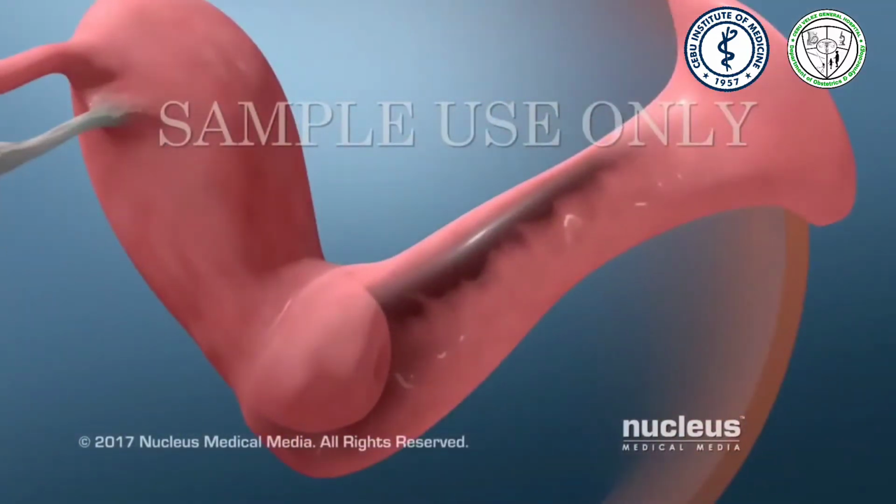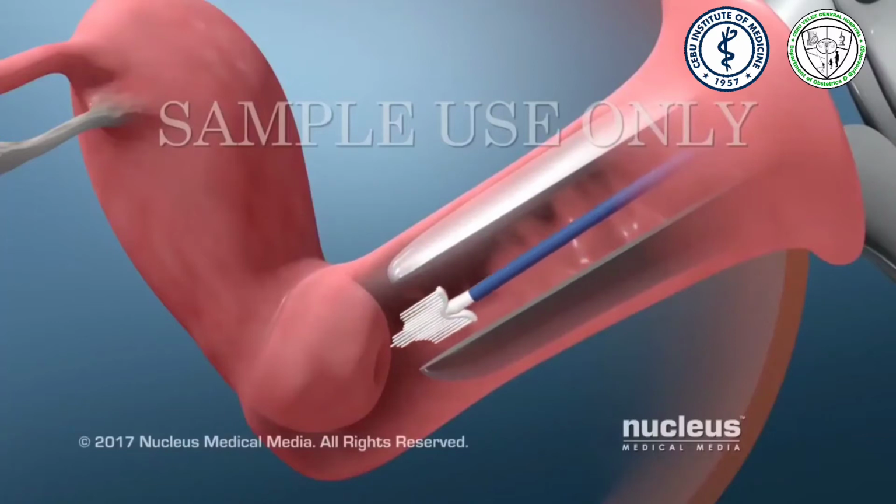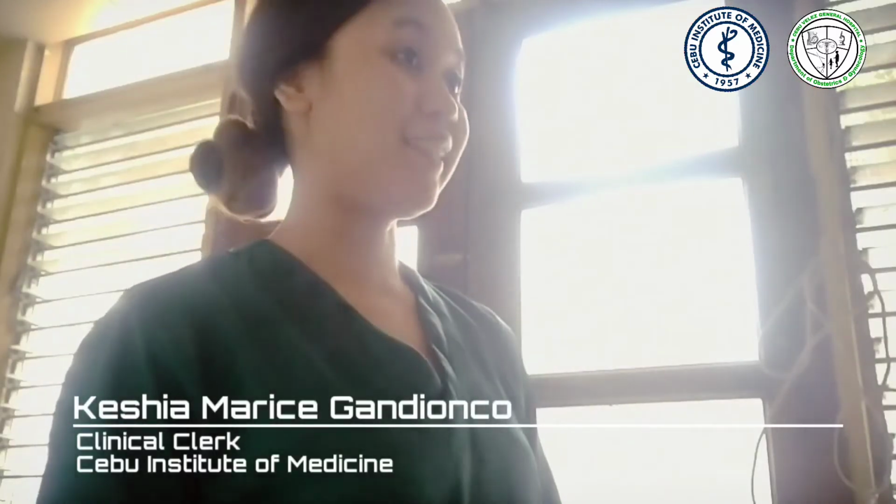A pap smear test is a procedure to test for cervical cancer in women. It involves collecting cells from the cervix. Starting, explain the procedure and ask for patient consent.